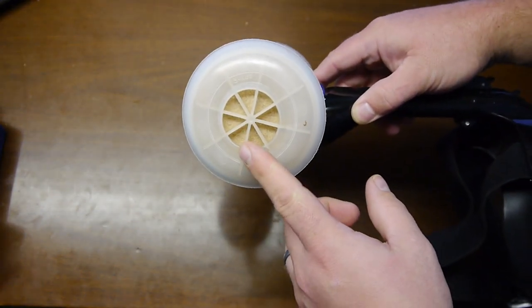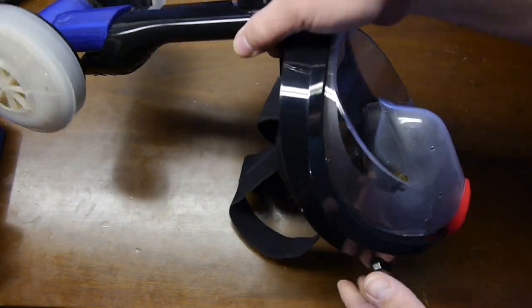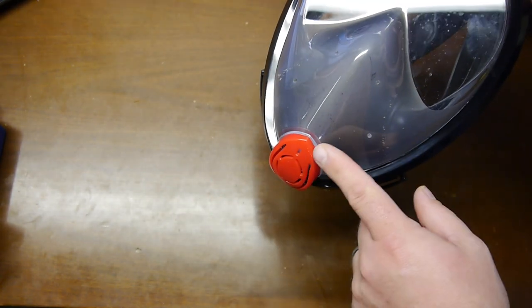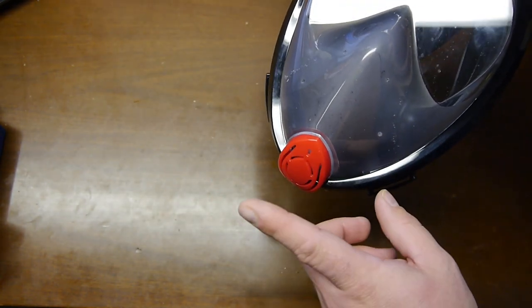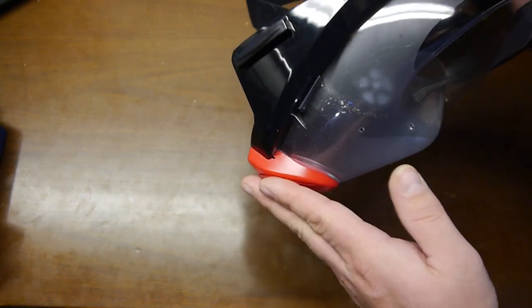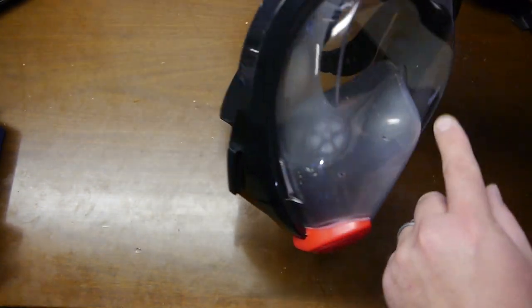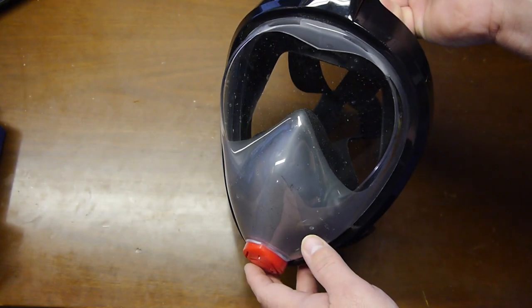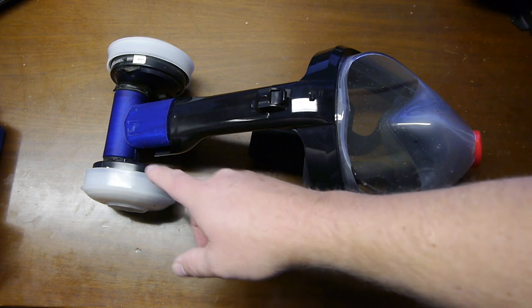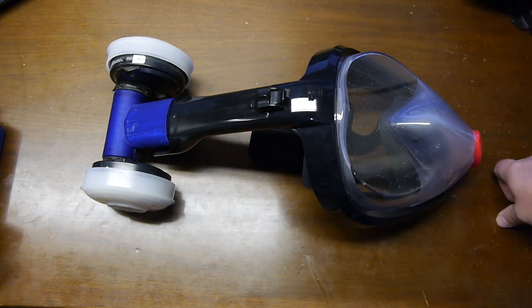Now if these were N95 or N99, then I'm sure they would provide a lot of protection. The check valve would still work here, so when you breathe out, air will come out of here. When you breathe in, there's a little disc in here that closes, and air is drawn through here, down, and into this rough face mask area. So as a cheap way of doing it, these cartridges are pretty cheap, and heck, you may have one of these lying around, potentially.